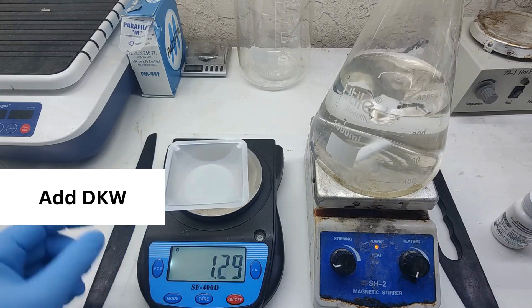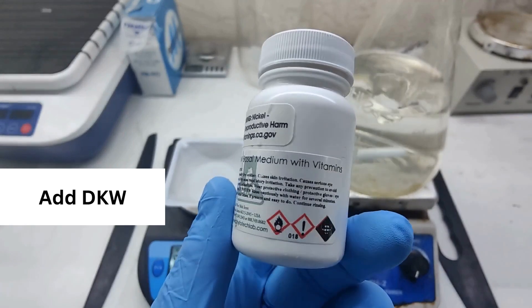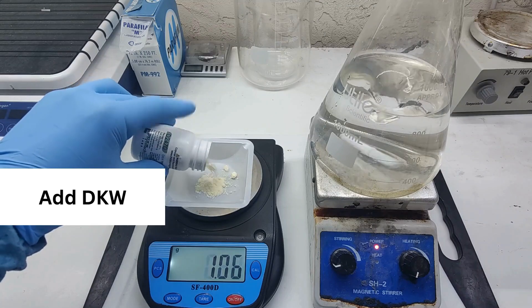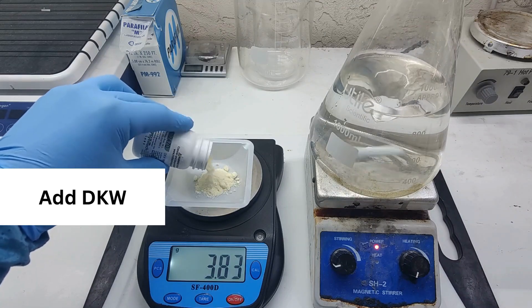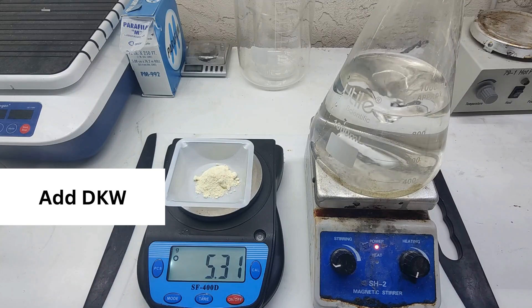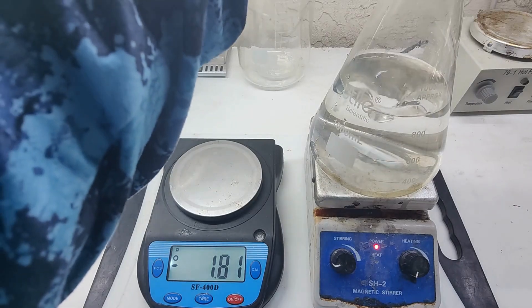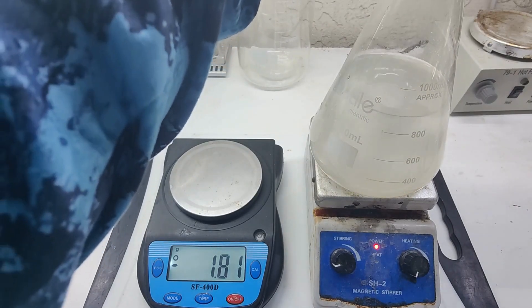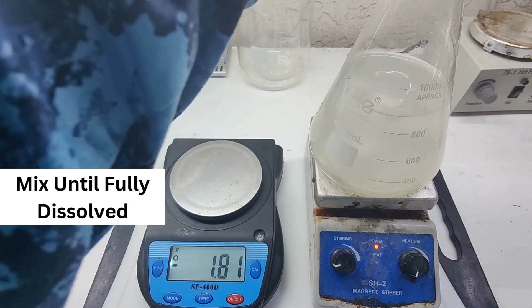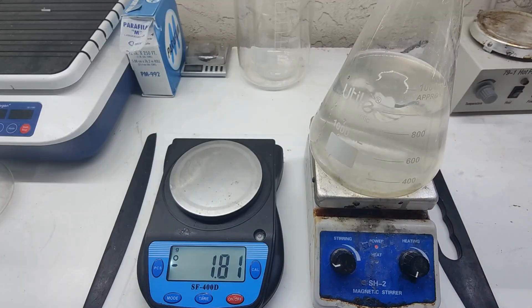Now we're adding our DKW salt media. There are a lot of TC medias available — MS is the most standard one, but MS does not work great for cannabis. It's pretty much universal for every plant except cannabis and hemp. DKW is the one — 5.32 grams. Now we're going to mix our DKW very thoroughly and make sure it is fully dissolved before we add our sugar. It usually dissolves pretty fast.